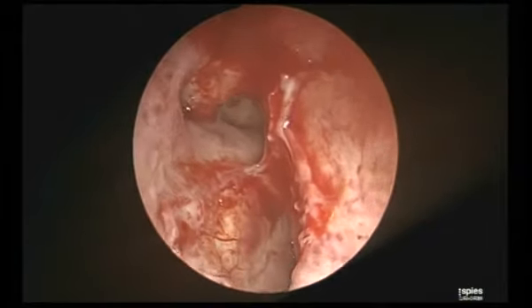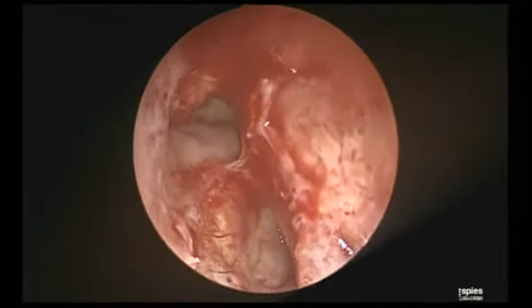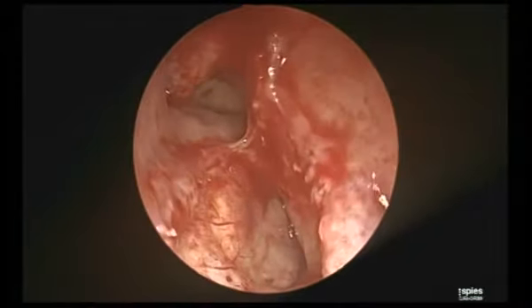That is the intersinus septal cell, and that cell behind it. This is the supraorbital recess. What we appreciated.